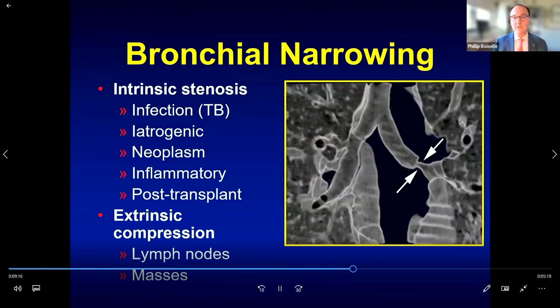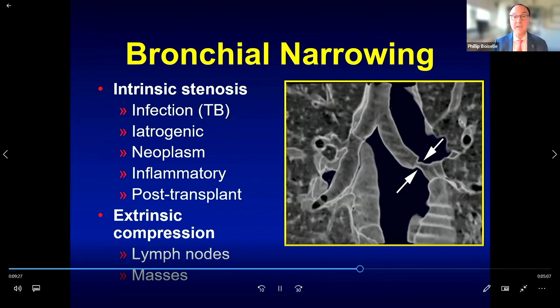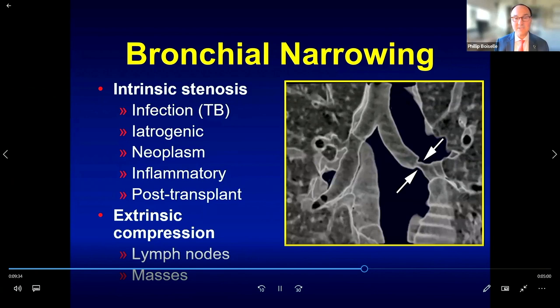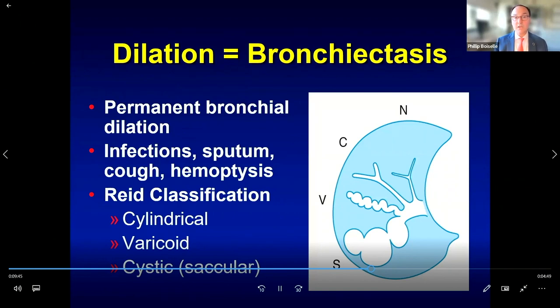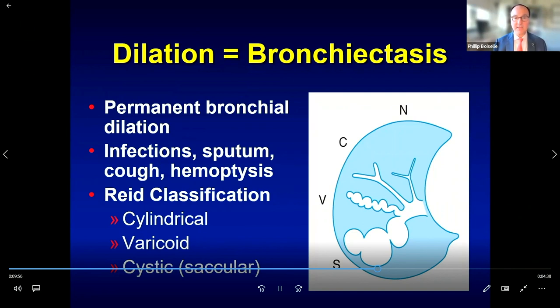Beyond endoluminal lesions, look for bronchial narrowing — either intrinsic or extrinsic. Intrinsic causes range from infections to neoplasms; you may also see focal narrowing after lung transplant. Extrinsic causes include adjacent lymph nodes or masses. One of the most important findings to look for is bronchiectasis — defined as permanent bronchial dilation. Affected patients present with infections, sputum production, cough, and hemoptysis. The Reid classification describes cylindrical, varicoid, and cystic bronchiectasis.